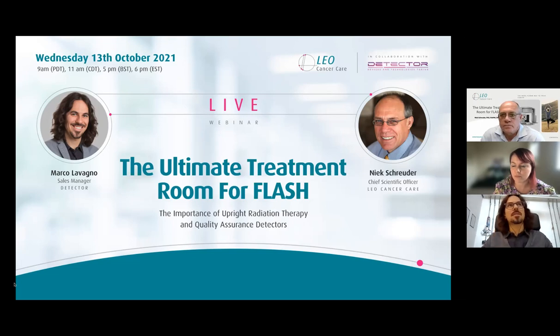Yeah, of course. We used to say, I don't know if it's already in English, that the blanket is short. So if you change the range from one side to the other, you have some parts that are not covered, let's say. So basically, of course, increasing the capability of the detector, in particular to catch the highest rates, you introduce more noise in your system, that's true. What we are dealing with is having a setup of ionization chambers inside the same beam monitor to measure both low and highest currents, to maximize the possibility of catching the beam currents.